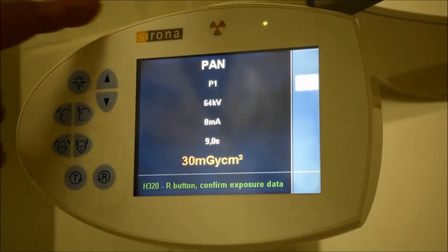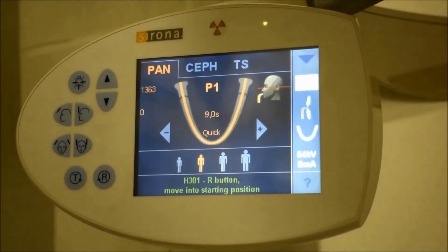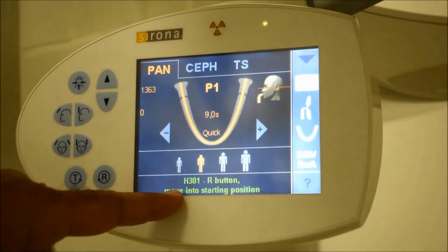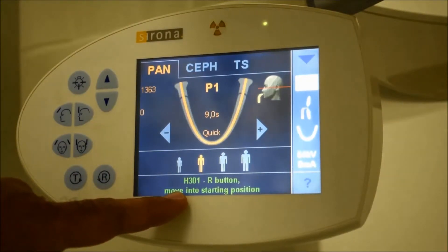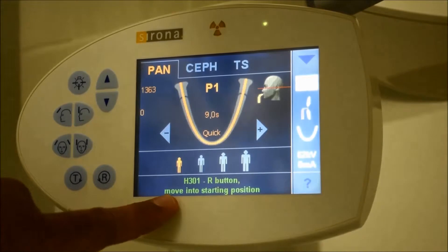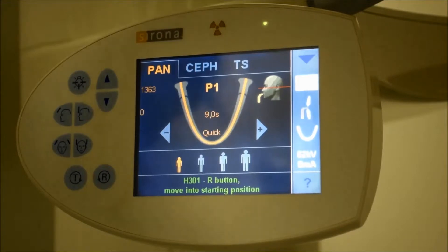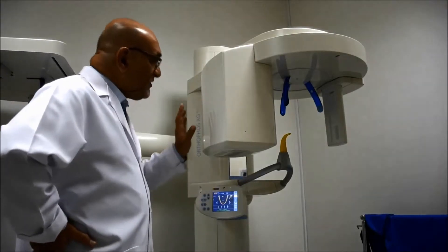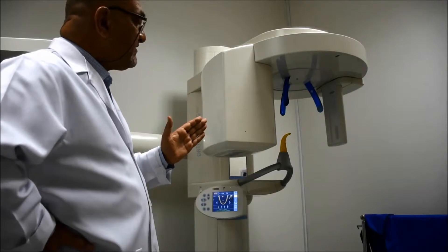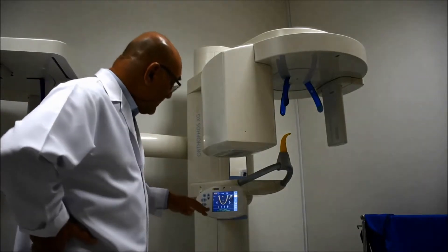Resetting is done by clicking on the R button. When you reset, you will see another error message: error number H301-R, which declares 'move into starting position.' This is not the starting position — it is the end position from a previous exposure. In order to activate the machine, you need to put it back into zero position from the starting point of the exposure.